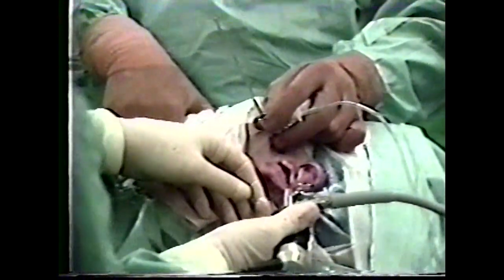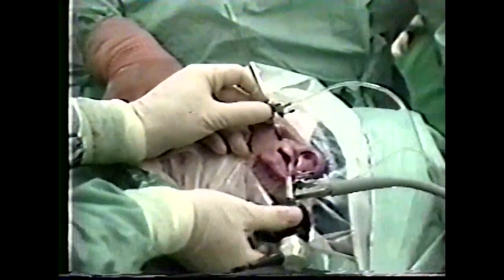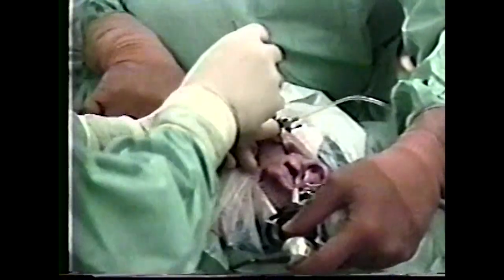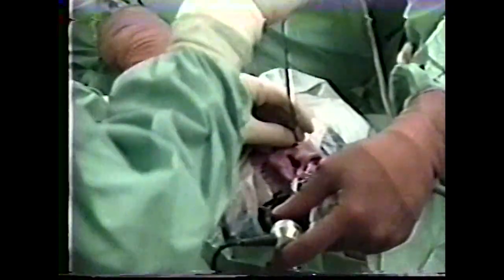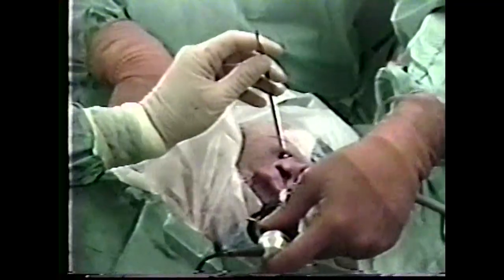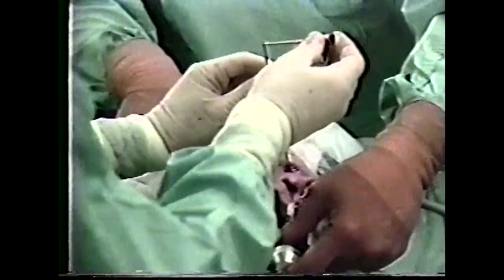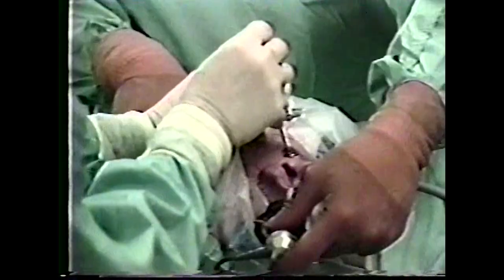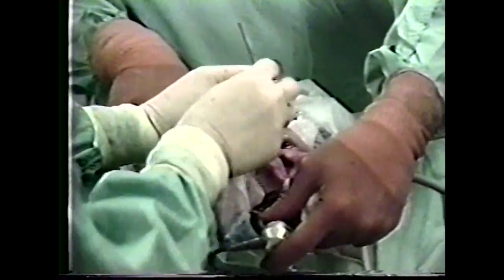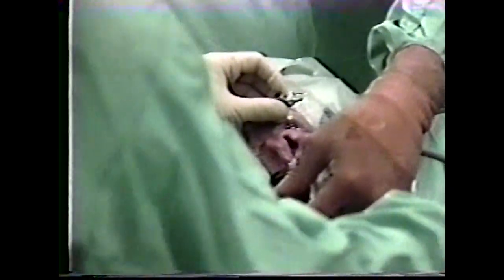To expedite changing the 15-degree to a 30-degree scope cannula in the infralateral portal, a switching stick is inserted and the 15-degree cannula pulled out over the switching stick. The 30-degree cannula can now be placed over the switching stick and guided into the joint. This prevents continual trauma to the capsule and the joint as various arthroscopic cannulas are interchanged.